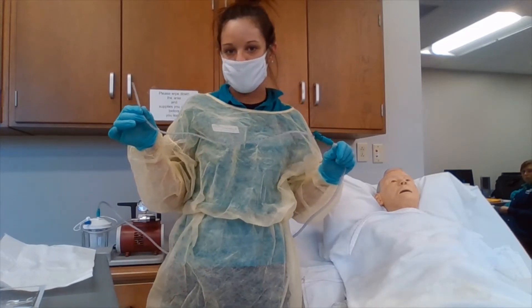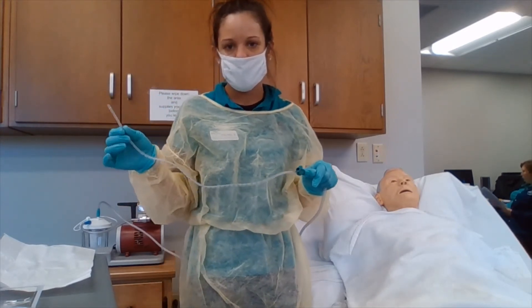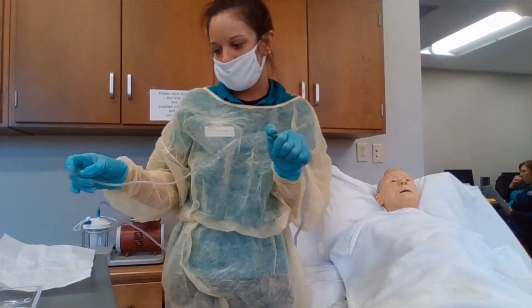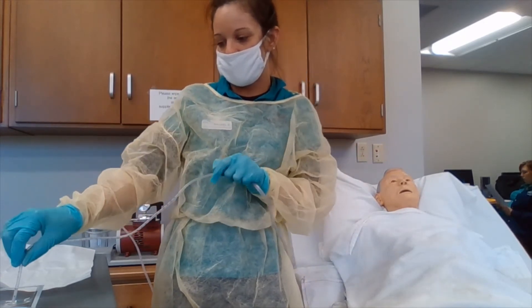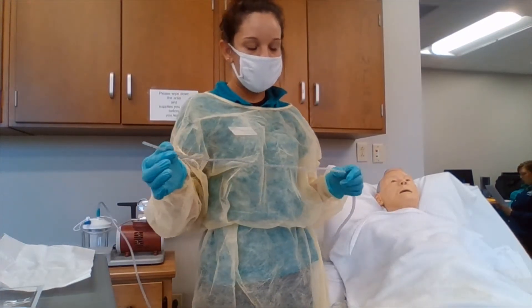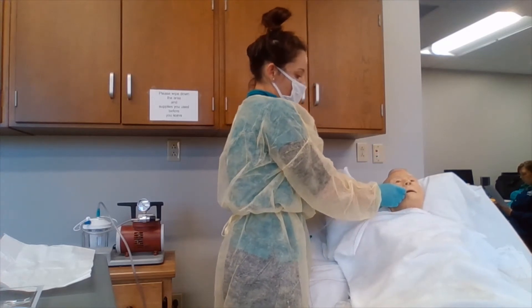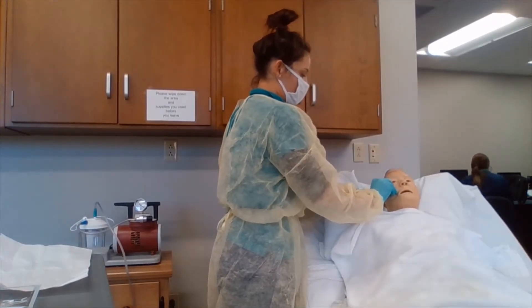For oropharyngeal suctioning, we are going to be lubricating with normal saline solution by pressing the thumb over the suction port of the tubing, dipping the end of the tubing into the saline solution, and suctioning a small amount into the tubing. We are going to approximate the depth: for oropharyngeal, it is from the tip of the mouth to the earlobe; for nasopharyngeal, it is from the tip of the nose to the earlobe.